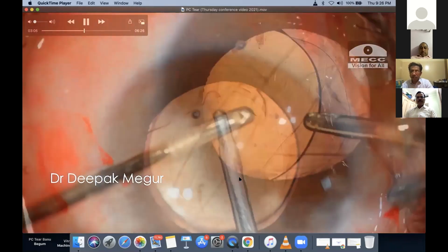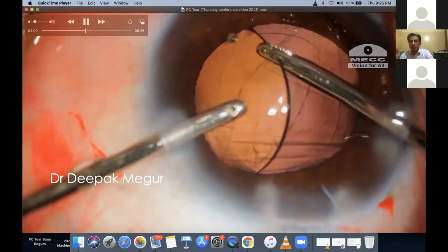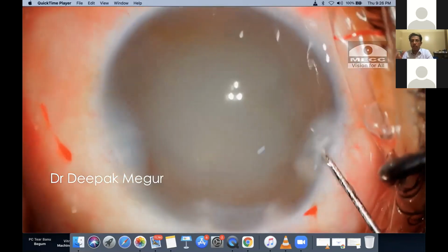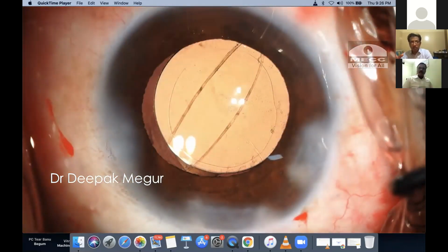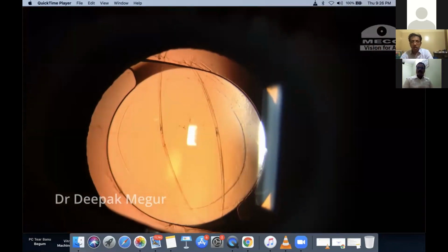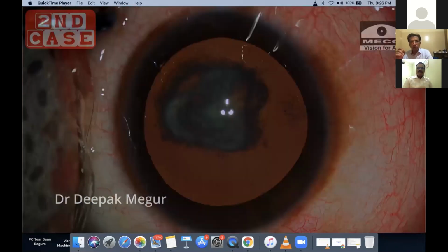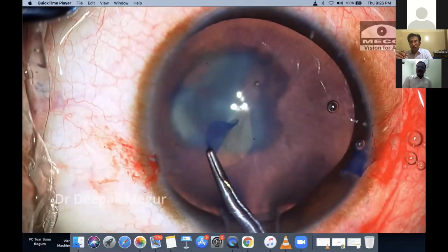And as you can see, I'm lifting the lens and gently irrigating. The bottle height is about 30 centimeters now. And you just wait for 2 minutes. Every bit of viscoelastic can be removed. And one final confirmation with Triesence ensures that we're sure that the vitreous is not disturbed here. So even in spite of a posterior capsular tear, we could achieve a situation where the anterior hyaloid was not disturbed.